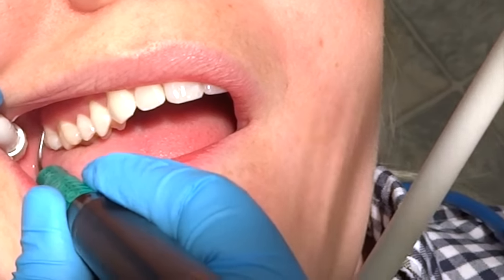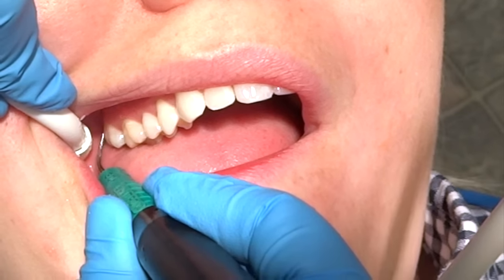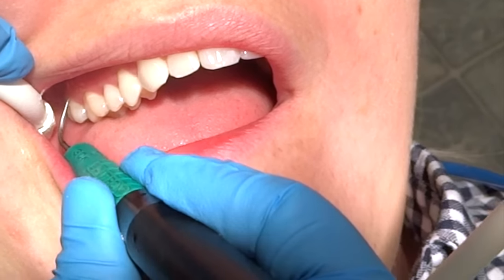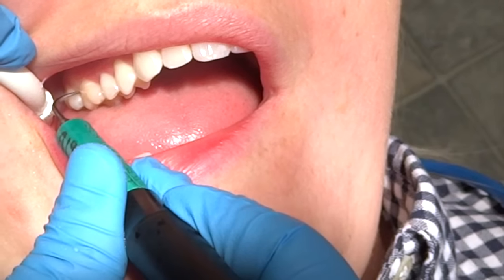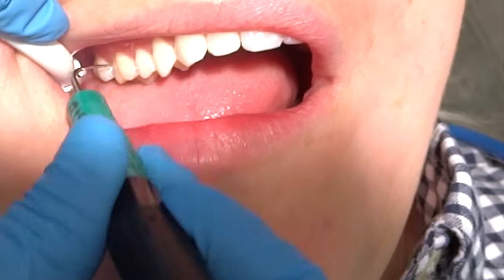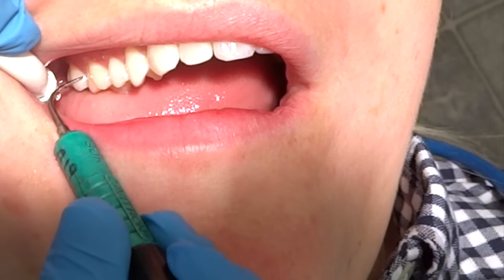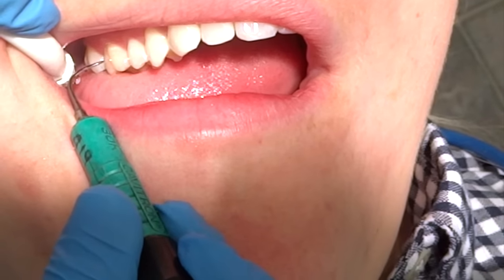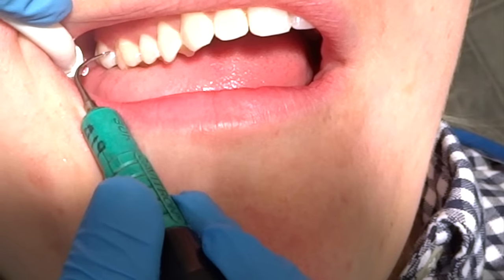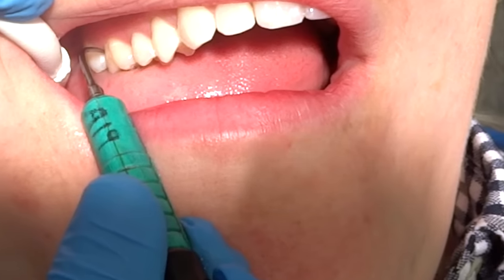The get-ready zone on the lateral side of my ultrasonic — move back. I'm using probe style here as I'm going apical, using multi-directional strokes. Watch as I come towards the mesial — I'm turning that instrument into a curette. I'm not using the back, I'm making sure I bring this down so it stays on the lateral side of the instrument. In order to be effective in calculus removal, you are tapping that piece of calculus from the crown area to the apex — so you're tapping the top of it.